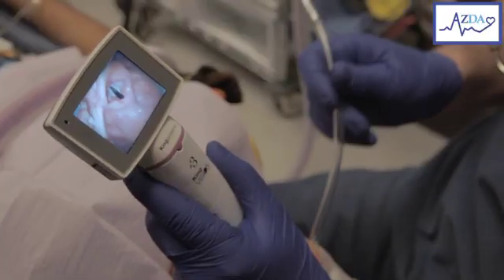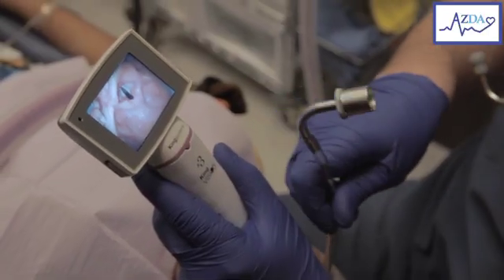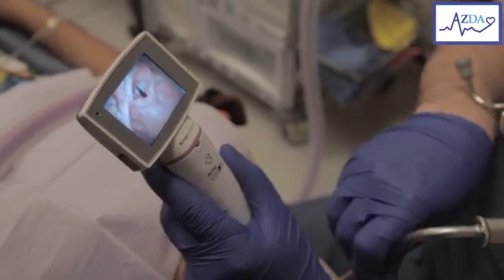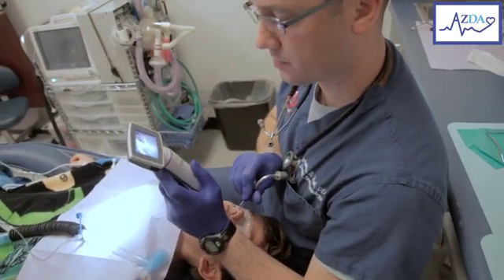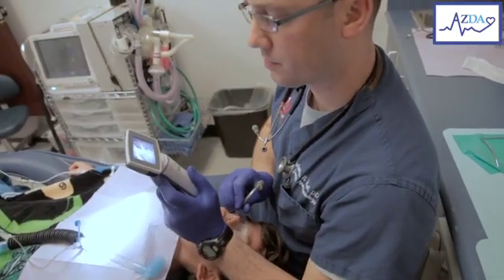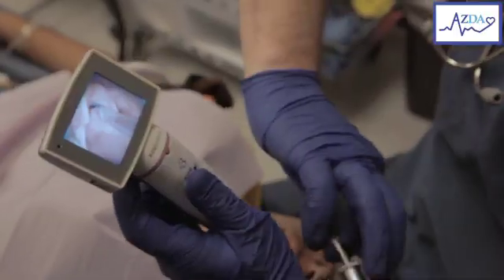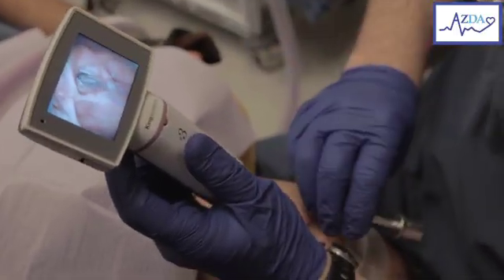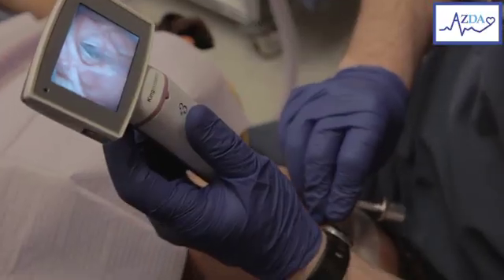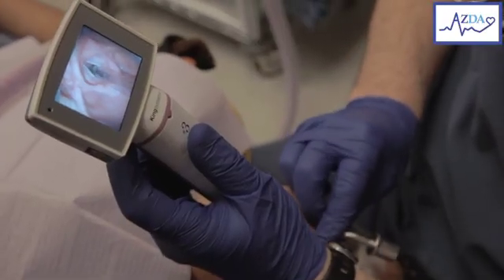Dr. Wall is using the KeenVision so that he can visualize the vocal cords. You can see how great the vocal cord visualization is with this device. The majority of the time there is a grade 1 view when using a KeenVision.